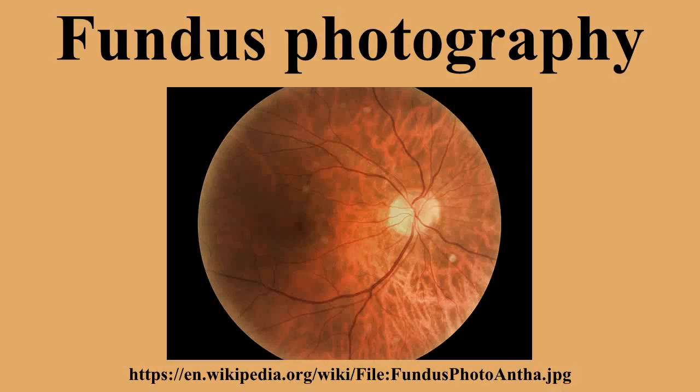Modes. Practical instruments for fundus photography perform the following modes of examination. Color, where the retina is illuminated by white light and examined in full color. Red-free fundus photography utilizes a filter in order to better observe superficial lesions and some vascular abnormalities within the retina and surrounding tissue. A green filter (540 to 570 nanometers) is used to block out red wavelengths of light.